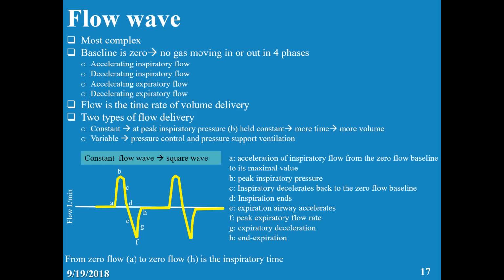Is there a hold here? Do you think that there is a hold? Yes, there is a hold, so this is volume control. It's very important to remember that there is a hold here. But the good news, it goes back to zero. But if you can see, it goes back to zero, but never pauses, it goes right away to the expiratory phase.